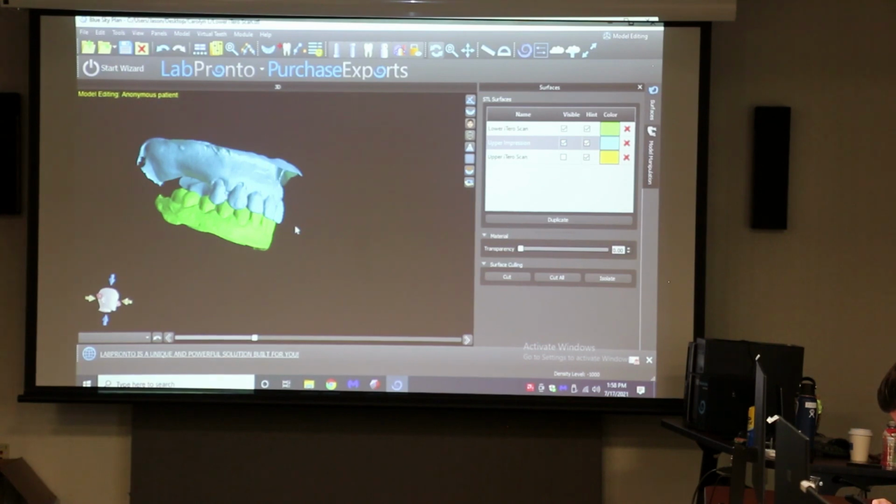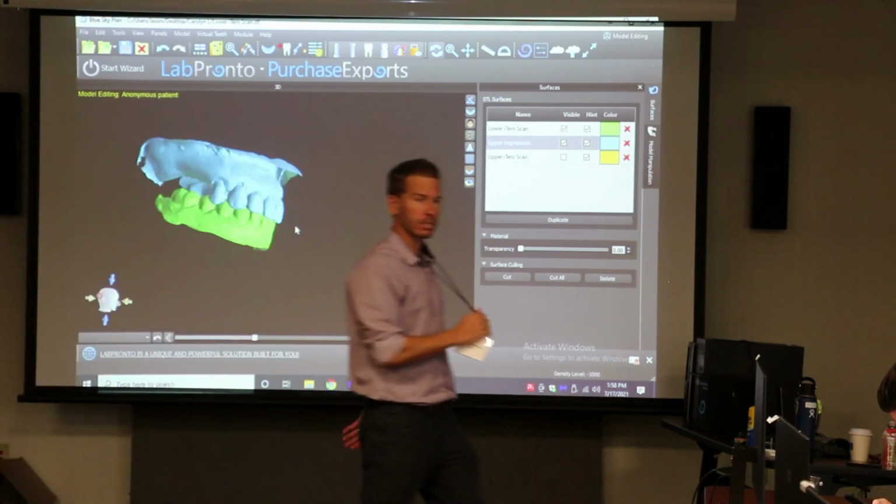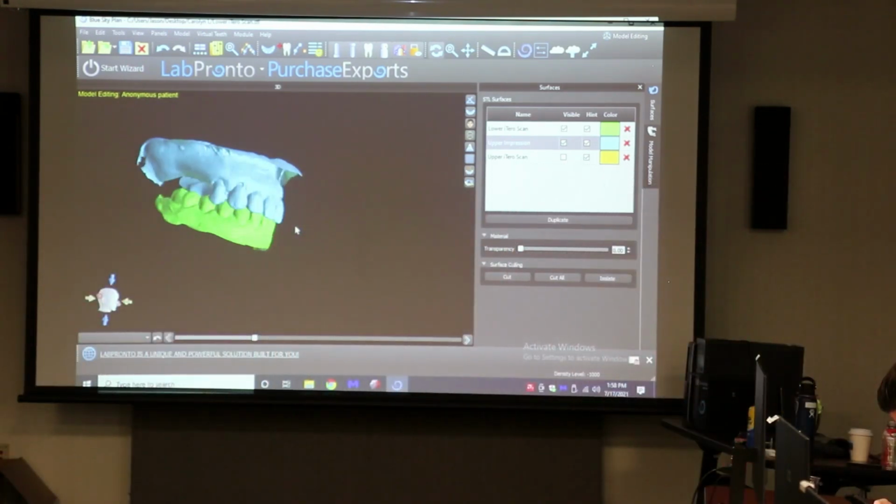Okay. Yep. So, this impression that has... We're hoping we can. I don't know if it's going to automatically do that inversion. Correct. Yes. That's what we need to figure out. So that's what you need to figure out, and I'll work with Brady too, and maybe try to follow up with you guys and make sure that's working well, that it's scanning, and we'll get it figured out. I just haven't put any effort into it. It hasn't been on my priority list.